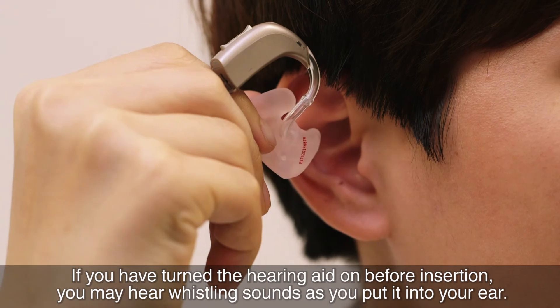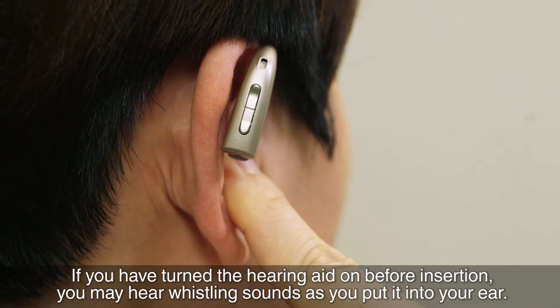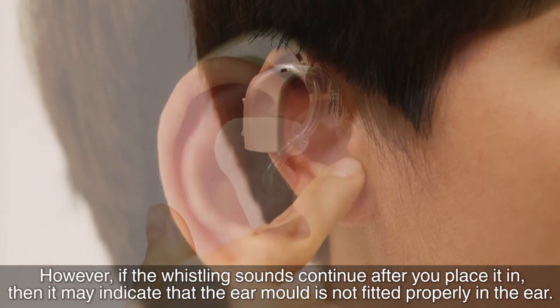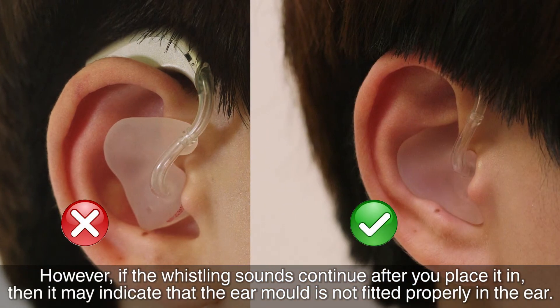If you have turned the hearing aid on before insertion, you may hear whistling sounds as you put it into your ear. However, if the whistling sounds continue after you place it in, then it may indicate that the ear mould is not fitted properly in the ear.